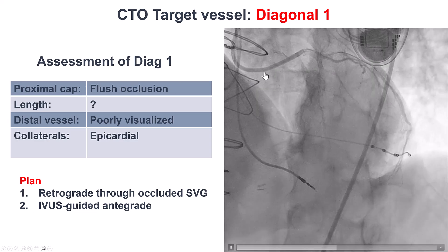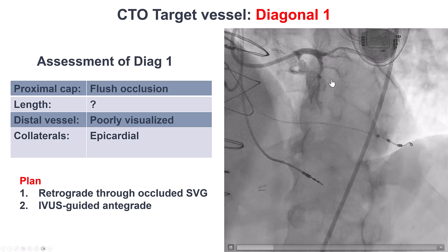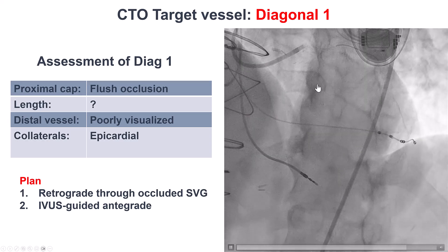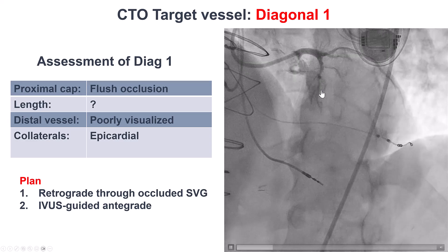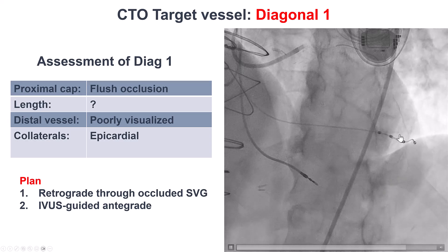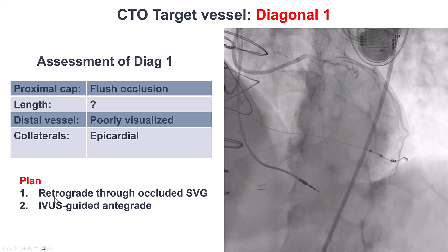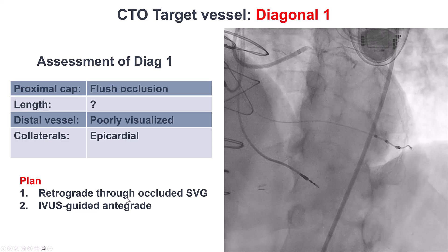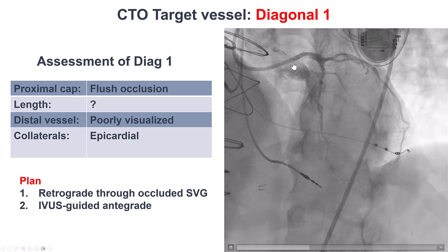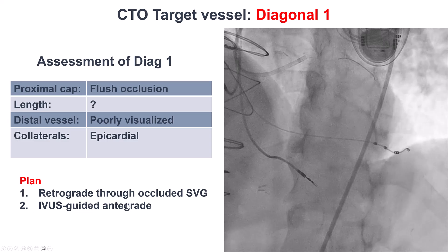Our plan was to try to recanalize the first diagonal CTO, the native vessel. We don't know exactly where it's coming from in the LAD, which has previous stents. We do see the distal vessel fill late through epicardial collaterals. Therefore, our plan was to try retrograde crossing through the occluded vein graft. And if that didn't work, try IVUS to see if we could locate the origin of the first diagonal.